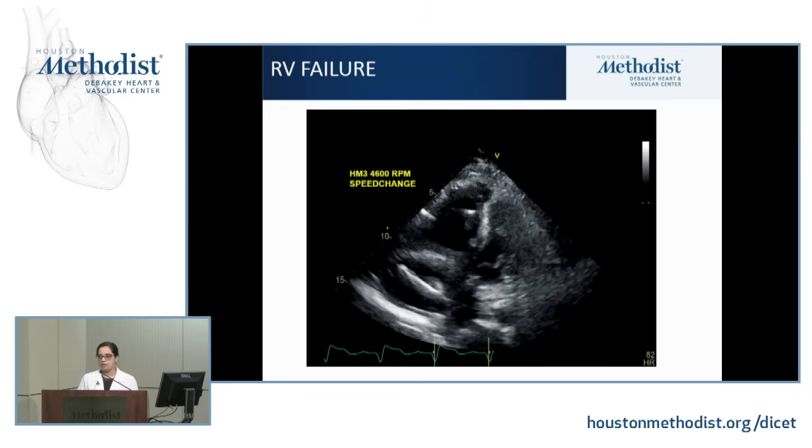For fellows: when you see patients who have hypotension and low index post LVAD, people think hypotension, sepsis, let's start increasing pressors. By the time I'm coming in, they've already injected methylene blue, which is the wrong thing to do for these patients. What you need to do right away is ramp the speed down, let the flow improve, let the septal interaction get better. If you have any confusion, you can get an echo and see what the septal interaction is like.